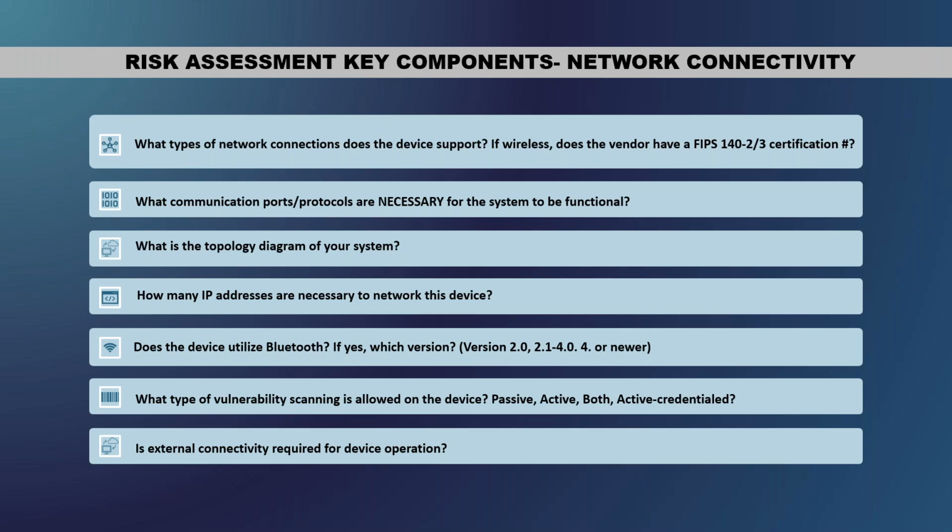I always recommend the latest version, but obviously some of them aren't. That's something you need to start asking, because a lot of times they just say it's Bluetooth compatible and you're like, okay, what does that mean? How are we using this? How are we going to use this in a hospital environment?